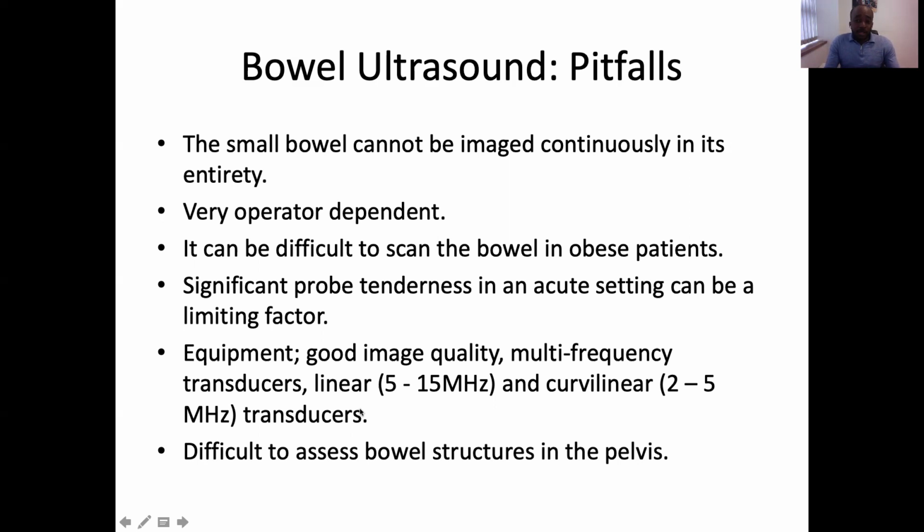You need very good equipment. You need very good image quality, equipment that gives you good image quality. You need multi-frequency transducers. We need to have at least a curvilinear and a linear transducer to be able to carry out a dynamic and complete transabdominal bowel ultrasound examination.